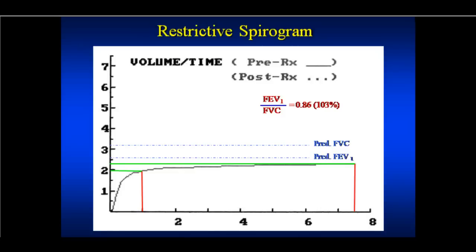That's what I think I try to demonstrate with this roving red line, is that the plateau, there's a nice long plateau. And in fact, on pulmonary function testing, you really want to look for a 2-second plateau as part of one of the quality measures of the test, the reproducibility measure of the test. All right. The predicted FEV1 is up here, and she was down here. There it is. Look at the ratio, though. It's going to become very obvious that it's essentially a fairly normal ratio. Look at this. The FEV1-FVC ratio is normal.